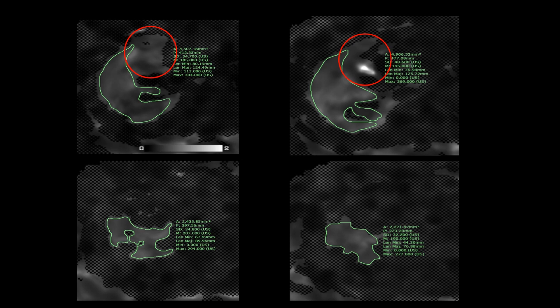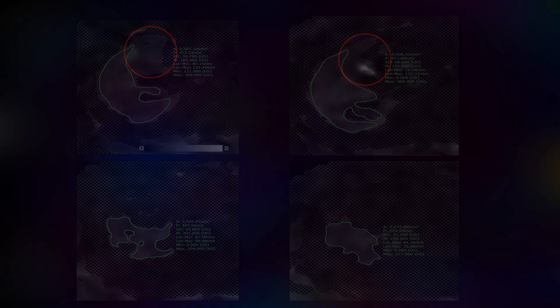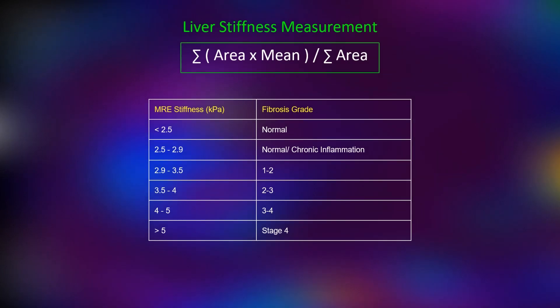We should draw at least 4 ROIs at 4 different levels, avoiding artifactual areas such as the gallbladder or regions outside the liver. We draw ROIs only in non-artifactual liver parenchyma areas and then take an average of the 4 values. The formula to measure liver stiffness is to multiply the area of each ROI by the mean liver stiffness value, summed and then divided by the sum of areas of all 4 ROIs. This gives the grading of liver stiffness.